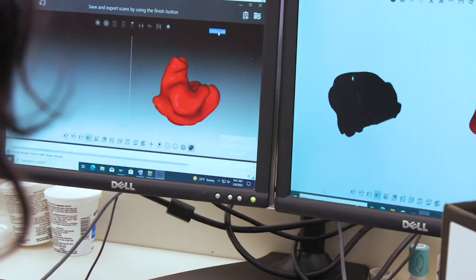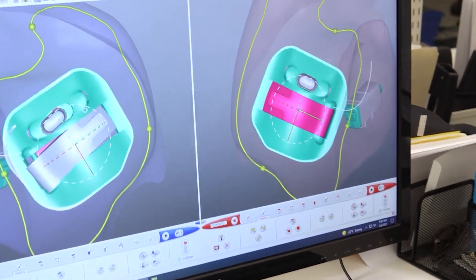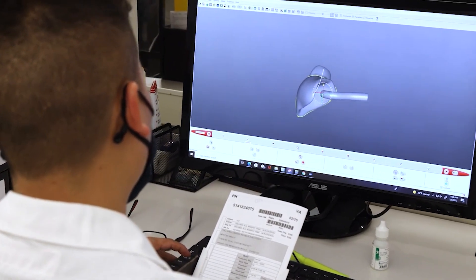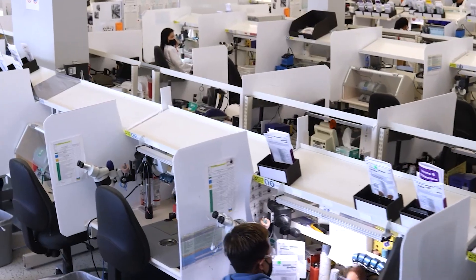Now, on to the various components that make the hearing aid. Working off of the results of the audiogram, audiologists and engineers work together with advanced computer-aided design, CAD software, to create the components that meet the specific needs of individuals with hearing loss. Once the design is finalized, manufacturing can begin.